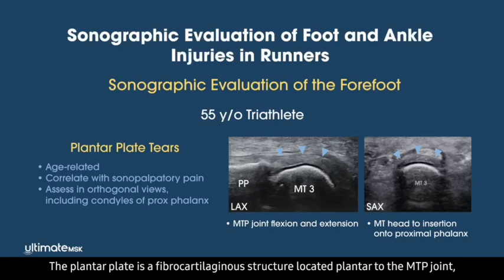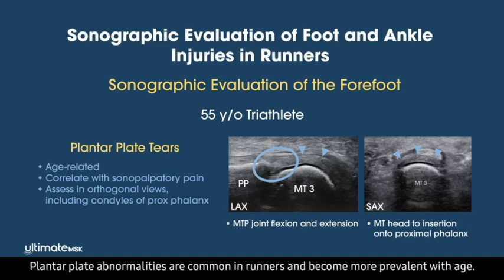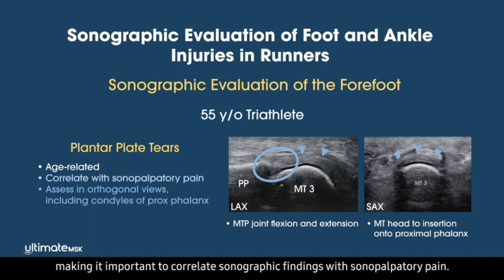plantar to the MTP joint, with most pathology occurring at its attachment onto the base of the proximal phalanx. Plantar plate abnormalities are common in runners and become more prevalent with age. However, they are often asymptomatic, making it important to correlate sonographic findings with sonopalpatory pain.